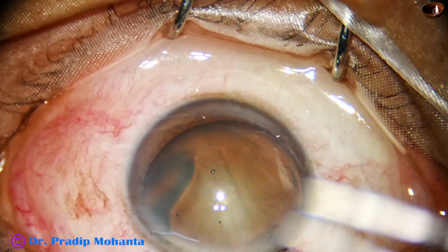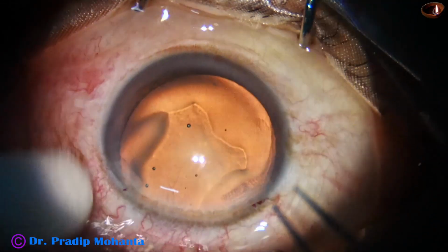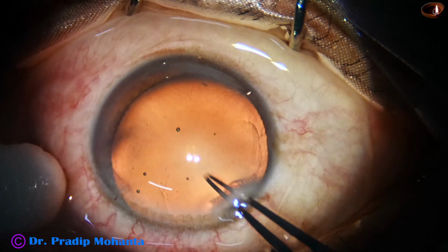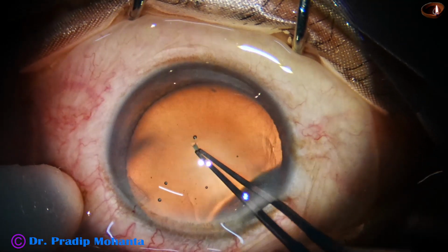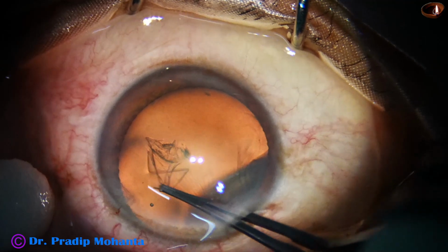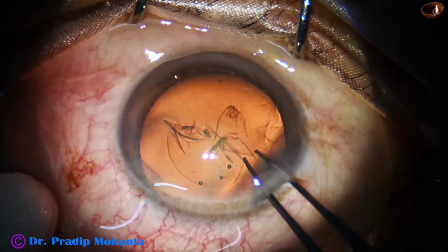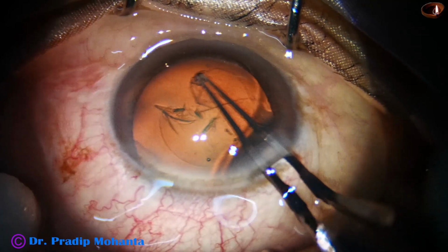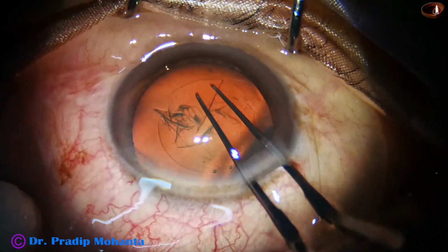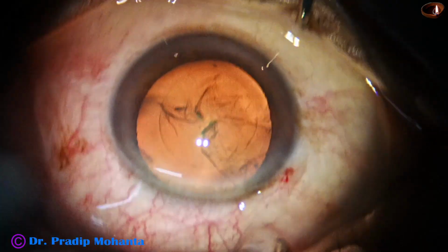Now capsulorhexis is to be done. This is the stereo coaxial illumination having a beautiful red glow. The anterior capsule is punctured. The capsular flap is guided anti-clockwise all around, and we get a very nice rhexis of about 5 mm.